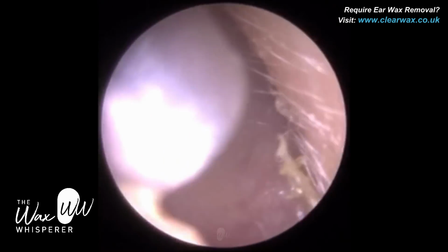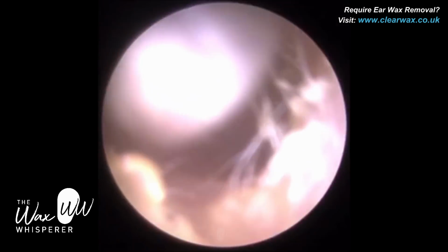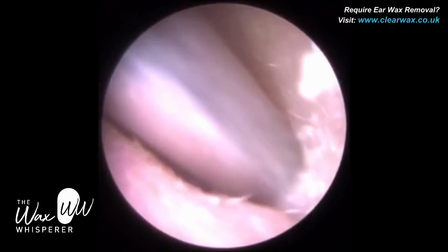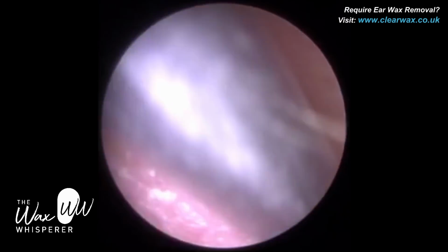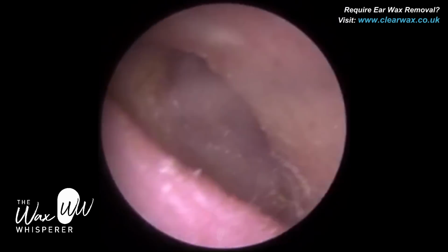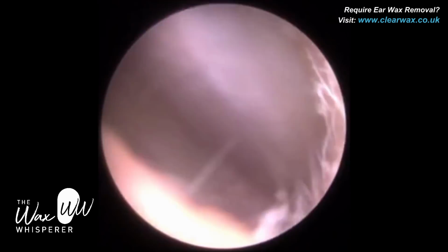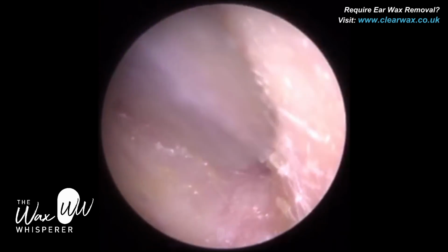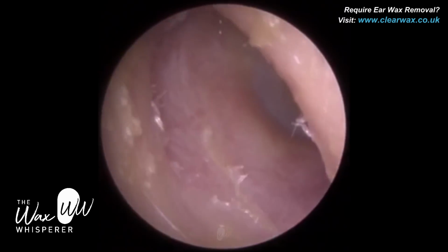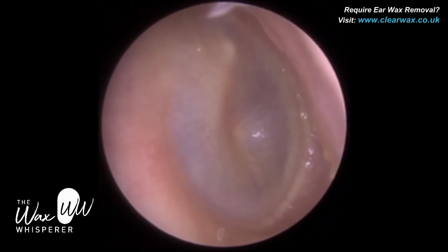With this patient, I just want to remove as much dead skin, wax, keratin as humanly possible. We can't always remove every little last speck because it can be uncomfortable for the patient. And we only really remove dead keratin when there's a clinical need. So for this patient, because he attends regularly with the same problem and it affects his hearing aid, removing as much dead skin as I can is important.